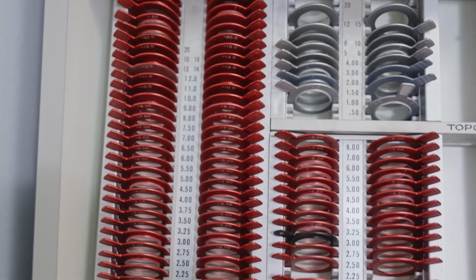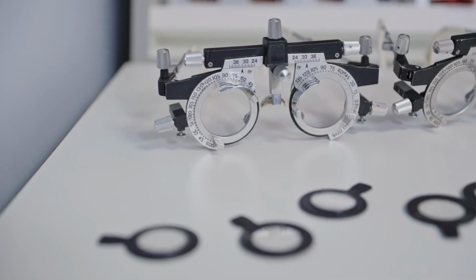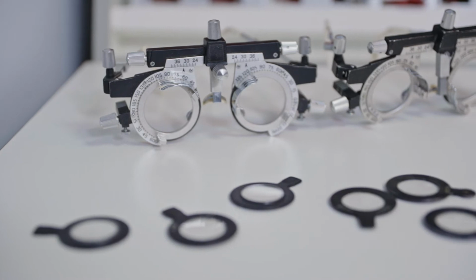An implant is a synthetic device that's put in the eye after cataract surgery. They come in various different types and various different materials and sizes and powers that we will individualize to each patient's eye and whatever their visual needs are.